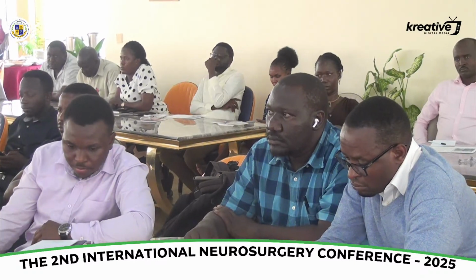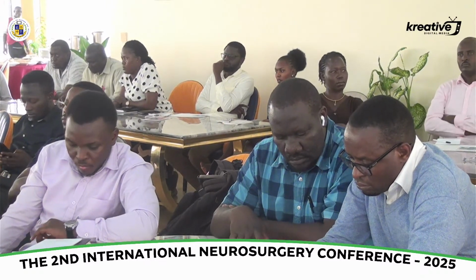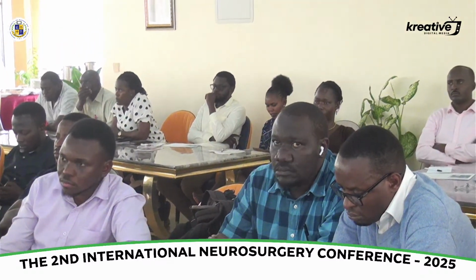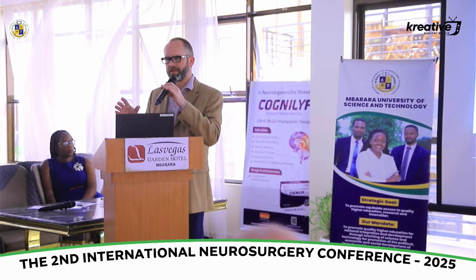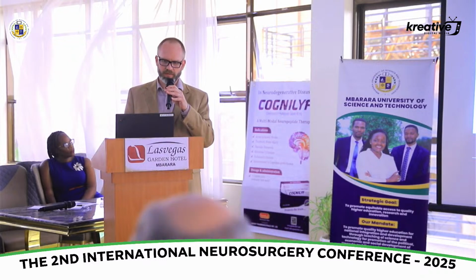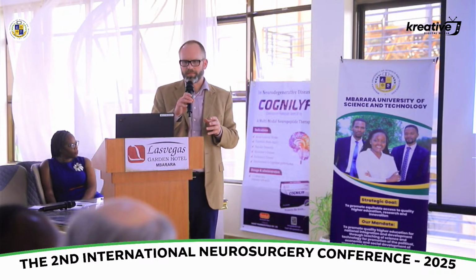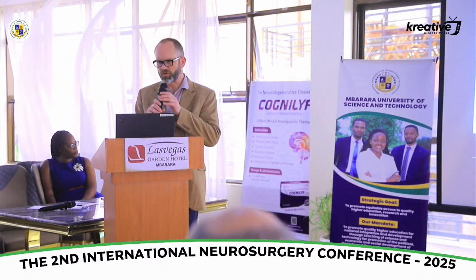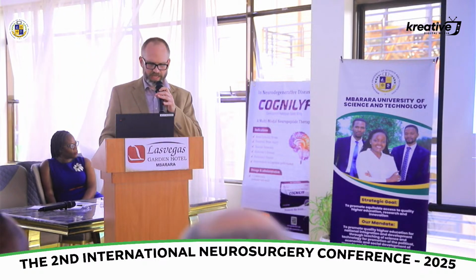This will be a quick presentation. We'll spend more time on adult ultrasound, but it can be useful to get online images or a textbook of pediatric or neonatal ultrasound of the head, just because radiologists have been doing this longer, because of the fontanelles being open, to get good ultrasound images of the brain for a very long period of time, for decades. So while it's not exactly the same as an adult patient at surgery with pathology, it can be useful to understand what's going on.